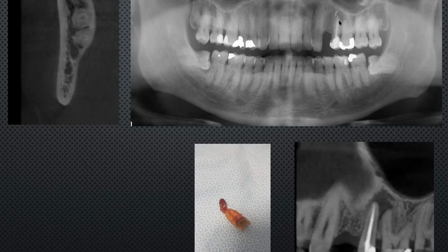And there are situations that... I mean, it's great. What I would suggest is do a few guided, okay, and learn from that. Don't just do it and close up, because it does speed up your treatment time, obviously. Do it and take it out, look at the osteotomy, put the direction indicator in, look to see how it's emerging from the ridge, so almost pretend you're doing it freehand and take that time, because you'll learn so much from that, so that when for some reason one day you come to place one freehand, you'll know exactly how it should look.